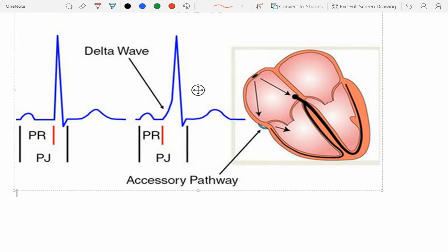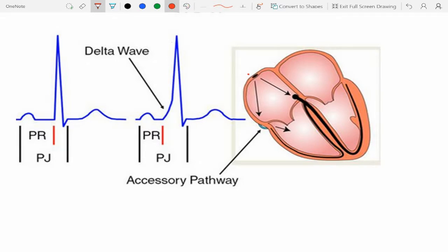This diagram shows that the sinus beat that's coming from the sinus node is traveling through the atrium, and basically electricity flows wherever it can. The annulus is basically a fibrous ring. So you can't conduct across the annulus because there is a fibrous ring between the atrial and the ventricular myocardium. So the only way you can normally conduct across the annulus from the atrium to the ventricle is this AV node, which traverses that fibrous ring. Yep. And specialized conduction system. So in that case, if you only conduct through that AV node and His-Purkinje system, you produce this delay in the AV node, which gives you that PR interval. Right. And that narrow QRS suggests that you're conducting all at the same time.